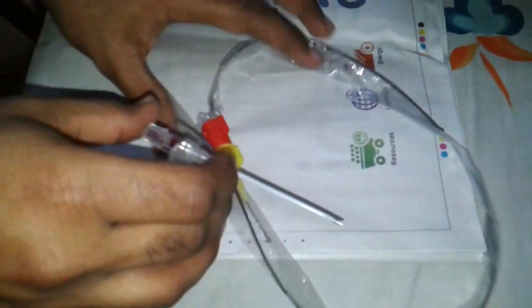Once the stilette is inside the vein, you will see blood coming inside the stilette. To make things easier, we will demonstrate it on the newspaper. First, we insert it inside the vein — like I have inserted it inside a vein.